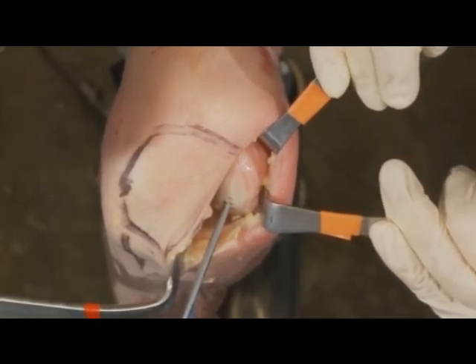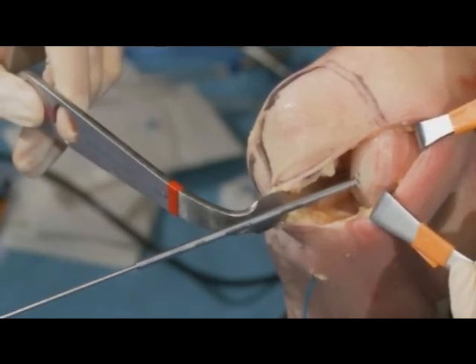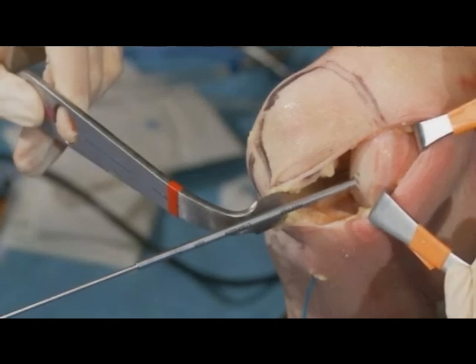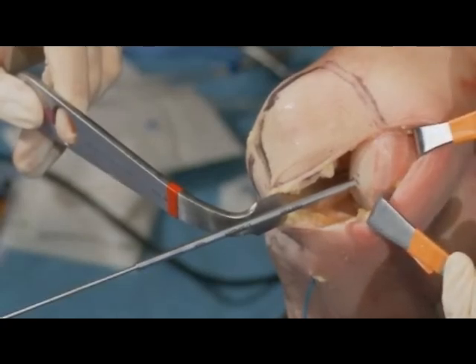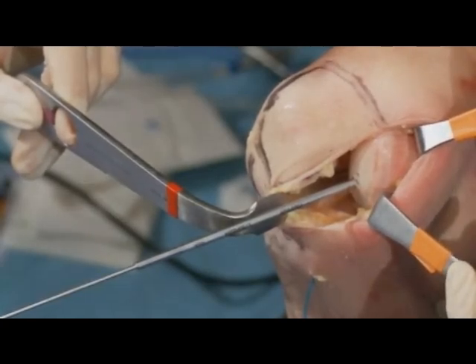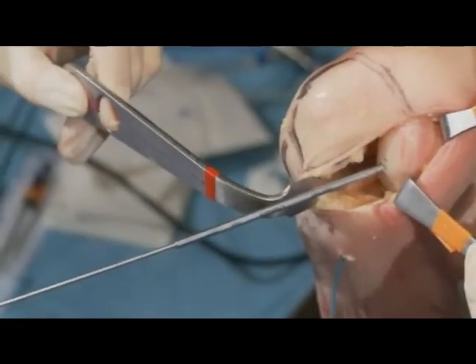And this is going to take away about 2 to 3 millimeters of subchondral bone for the implantation. So you can see that there's very minimal bone resection. And the good thing about this is that if you ever have to revise this to a total or to a unicompartmental, or to be honest with you, even if you wanted to do a massive allograft procedure, you can still revise it because we take away very little bone.